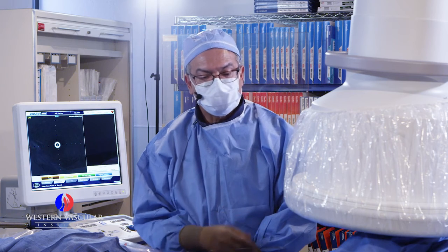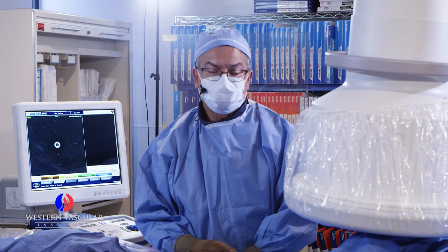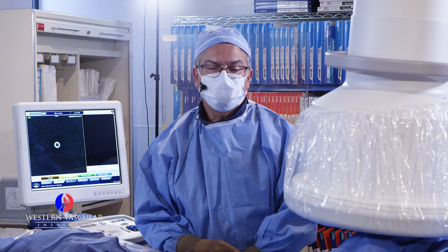All that she will have at the end, I will use a little closure device for the puncture site. And from here, actually, she's going home. So definitely there's a big difference between the two approaches.